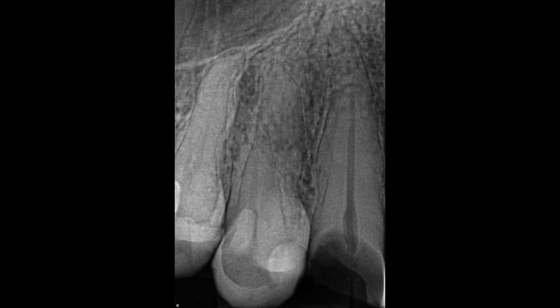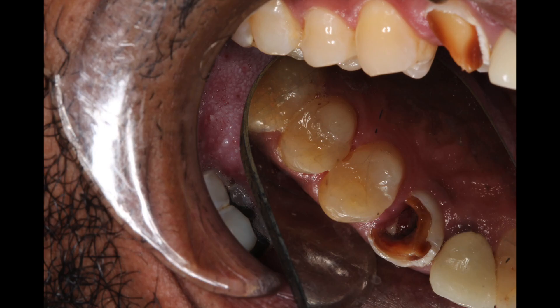Let me introduce you to Brian. He came in with pain on tooth number six, broken down to the gum line. Here's an x-ray and a photograph. This case is pretty simple — the only question is whether this can be done as an immediate implant. Our 3D x-ray that day showed us that an immediate implant wasn't possible because three quarters of the implant wasn't going to be in bone, or we'd have to angle it way out of the buccal, which won't give a good cosmetic result. So we're going to extract and graft.